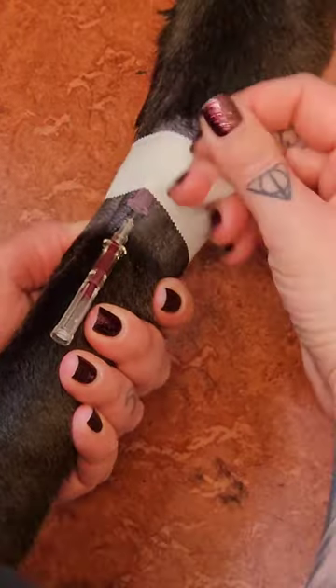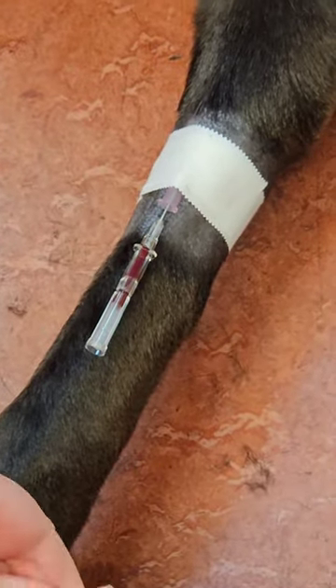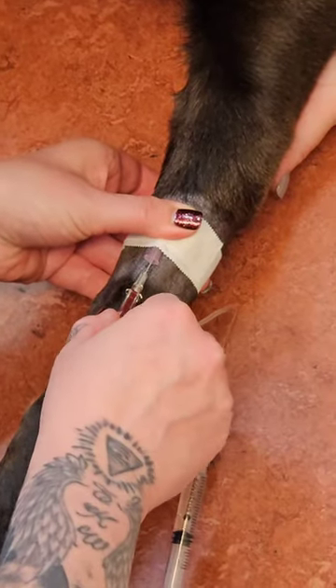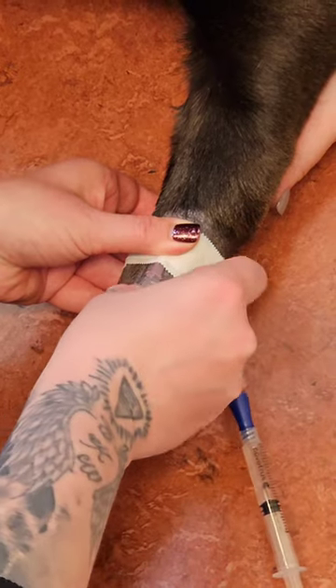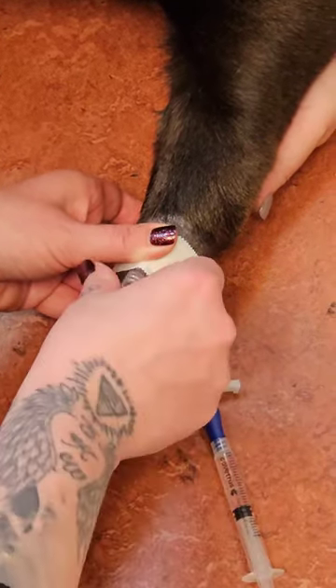Now she's anchoring the catheter down with one piece of tape, and now she will be putting a t-set in. She's applying pressure at the point of the catheter so the blood doesn't rush all out, and now she's putting the t-set on. Be sure to tighten that nice and snug.